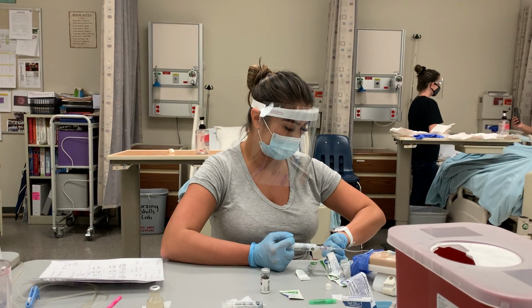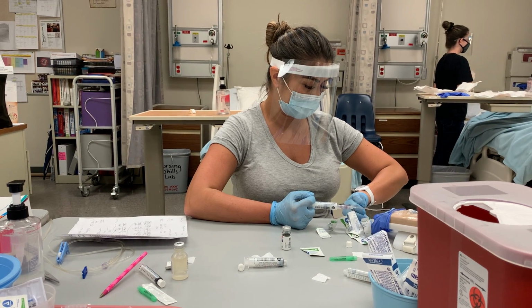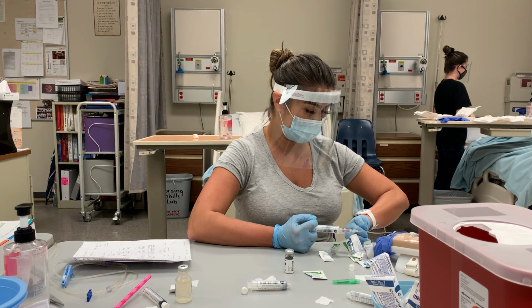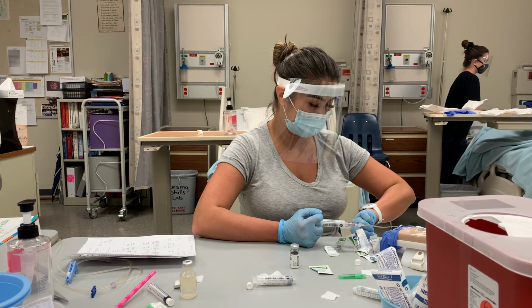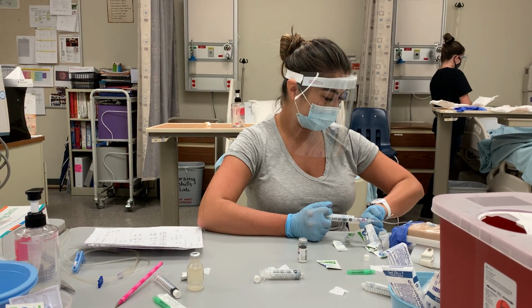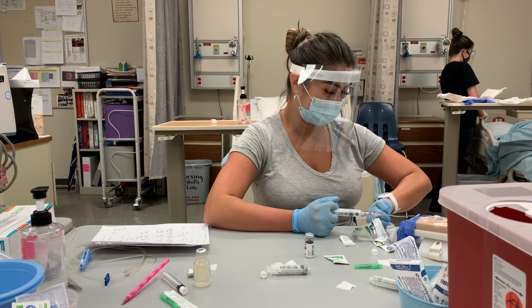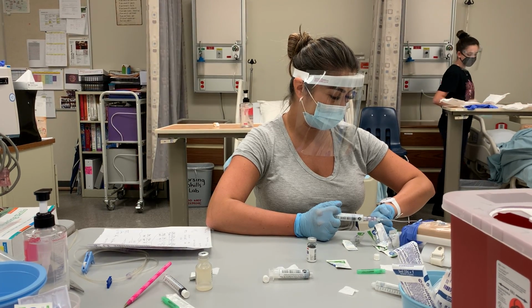I will document how the patient tolerated the procedure, that I cleaned out the dressing, the time, and the date that I did it. And I will make the patient comfortable, raise the side rail, lower the bed, then remove the mask for the patient, because now we can remove the mask.